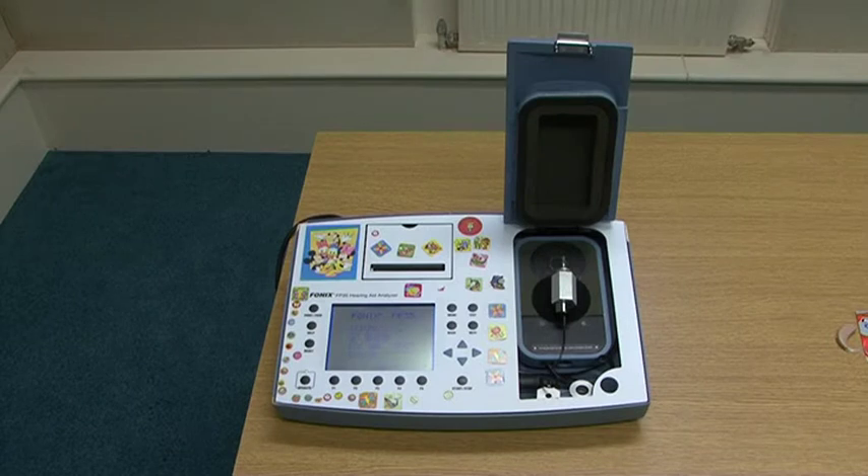This is the Phonix FP35 hearing aid analyzer, also known as the test box. In the last 10 years, it's become the most popular device for the monitoring and setting up of hearing instruments and personal FM systems used in education around the UK. There have been many changes and revisions, primarily to the firmware installed, which can be identified by the version number displayed on the start-up screen. Currently it is version 6.10. If you have an older device, it's recommended to have an upgrade to get more functionality and compatibility with the newer digital hearing aids.